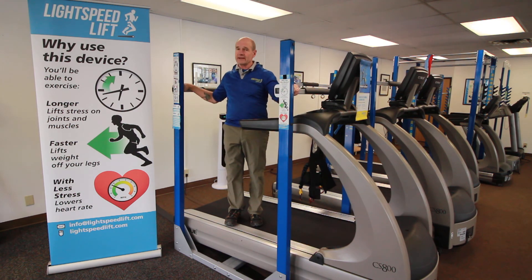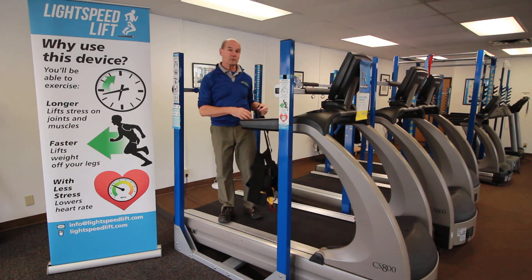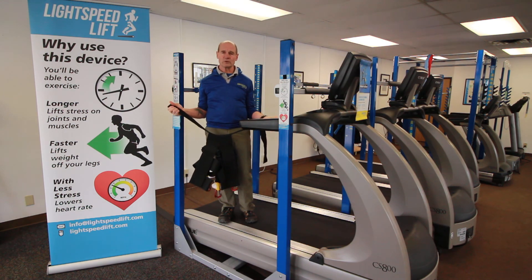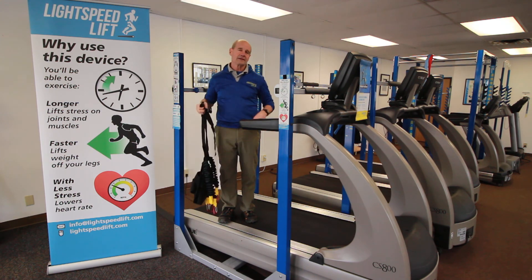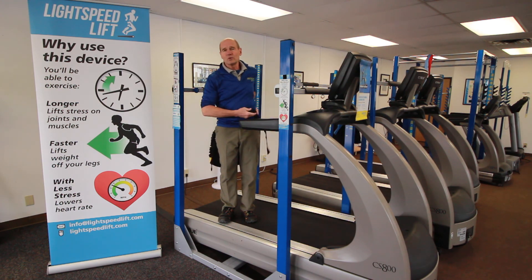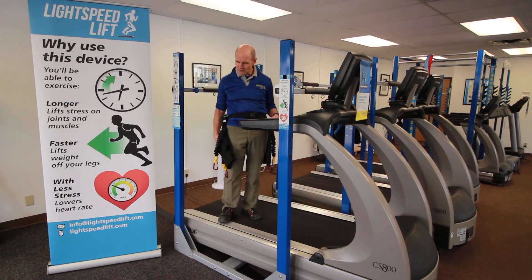Everything is now set as a body weight support system — five seconds. The next step would be putting on a belt. The belt was developed to fit right over street clothing so that people can test this out. We can fit somebody with a 20 inch waist all the way up to a 72 inch waist.